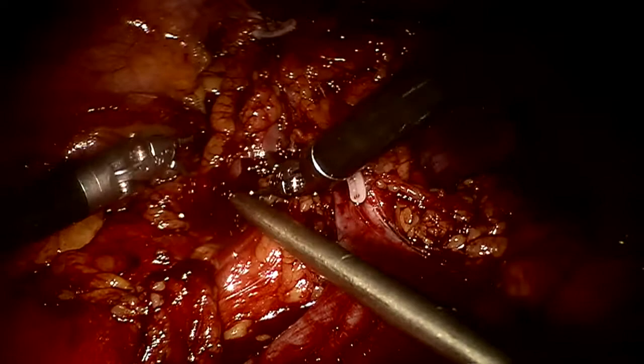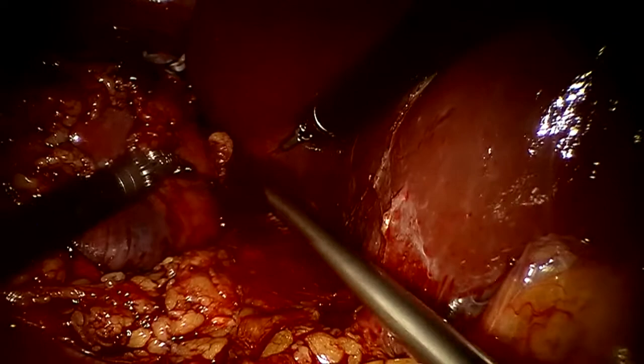Okay, it's fine. All right, suction here. Excellent. All right, Jackson Pratt drain, please.